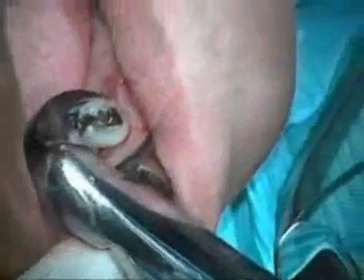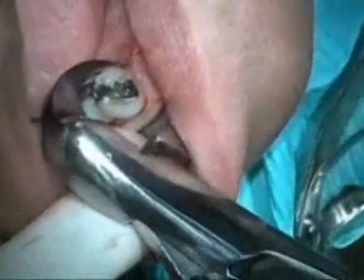Again, the beak is set deep in the lingual sulcus, the bumper low on the alveolar ridge at the mucogingival junction. With a small movement, the tooth is then removed occlusally.